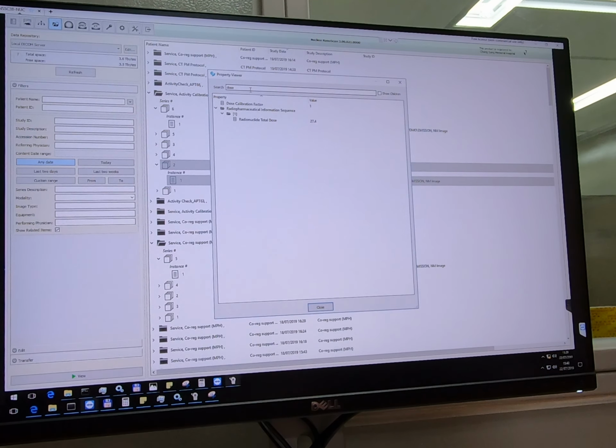And do you remember which one stops in more angles to grab the projections? Yeah, the pin SPECT. Okay, and do you remember the numbers as well? 24. Just guessing. So it was 10, 10, and 14. 10, 10. Yeah, don't ask why it is the same for the fast and the standard.